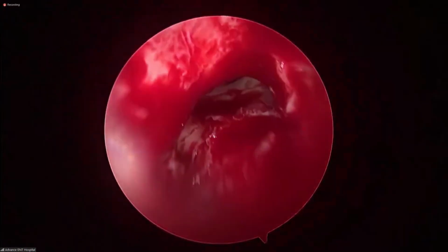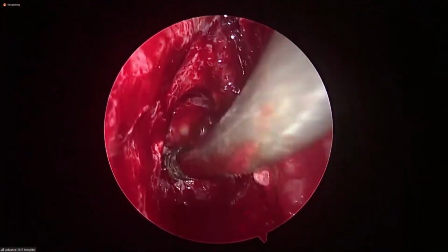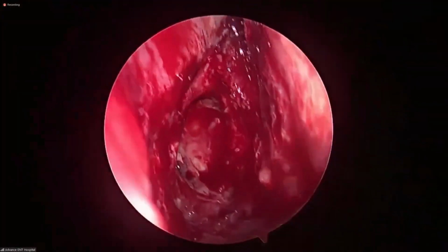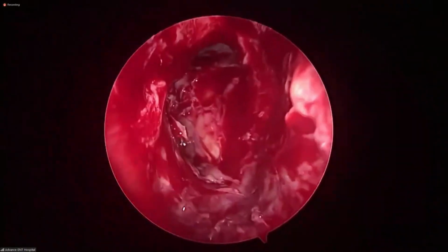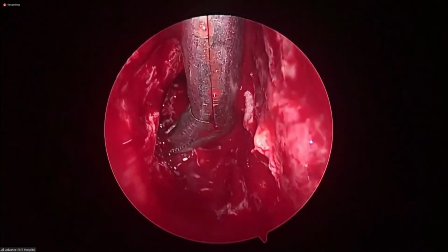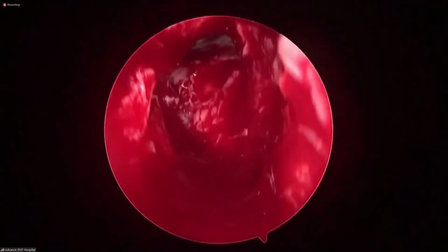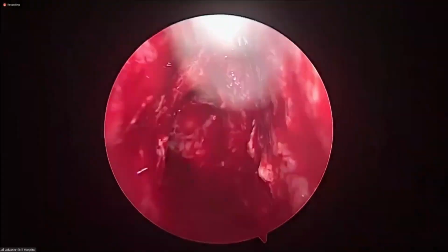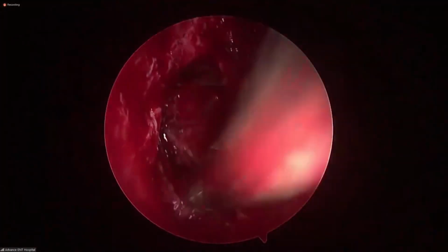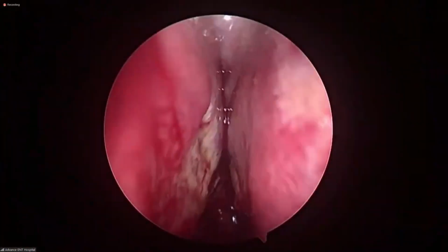See this? See how nice the frontal opening is now. Very beautiful, sir.